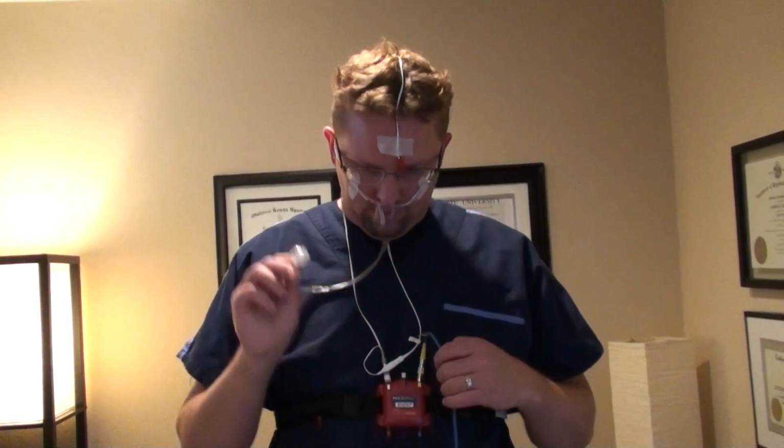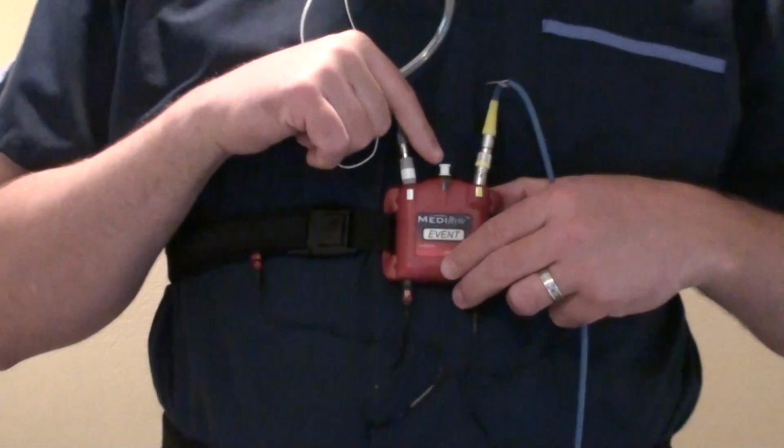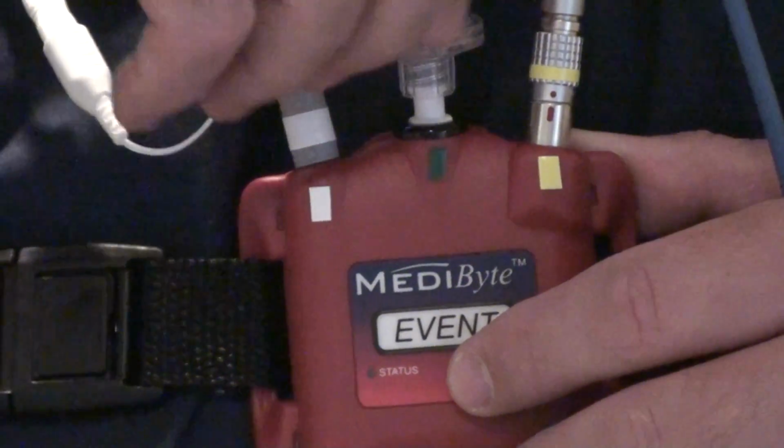On the MediByte, screw the filter on the end of the cannula to the input marked pressure. It's in the center of the MediByte and marked with green tape. Do not over-tighten the filter.